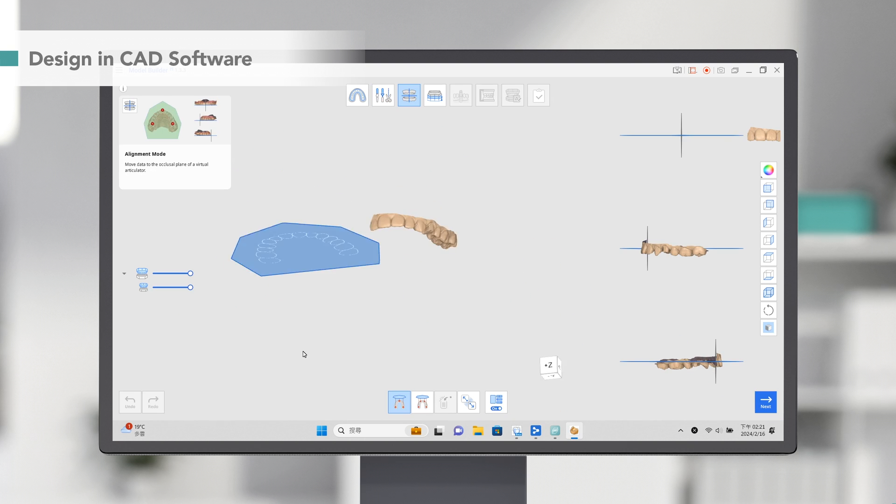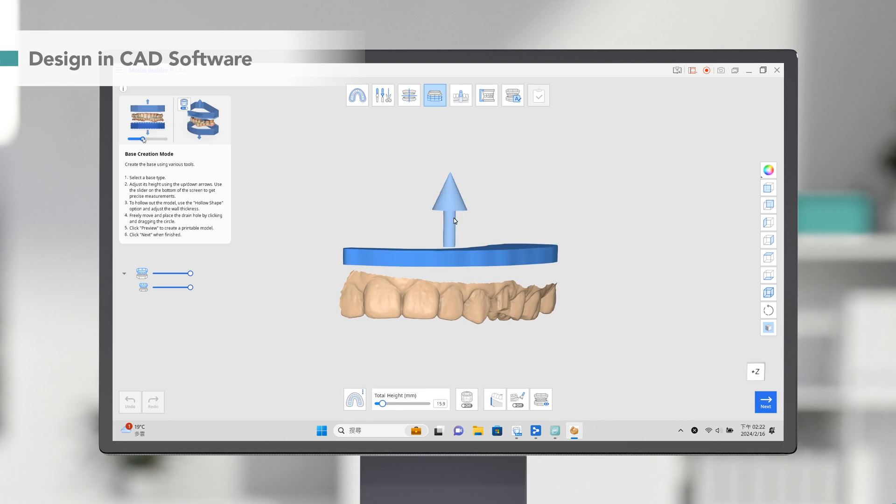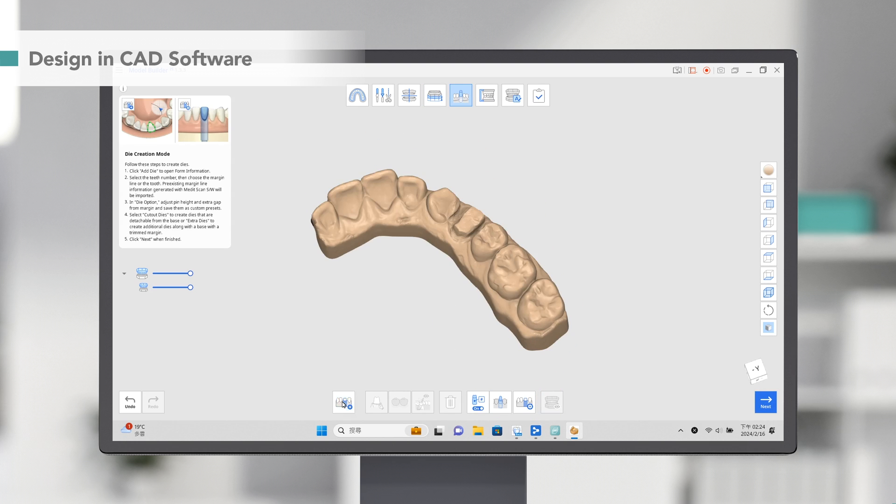In the alignment mode, rotate and adjust your scan to ensure it is perfectly aligned with the occlusal plane. Go to Base Creation mode, where you can adjust the height. After the base, let's move on to creating the die.